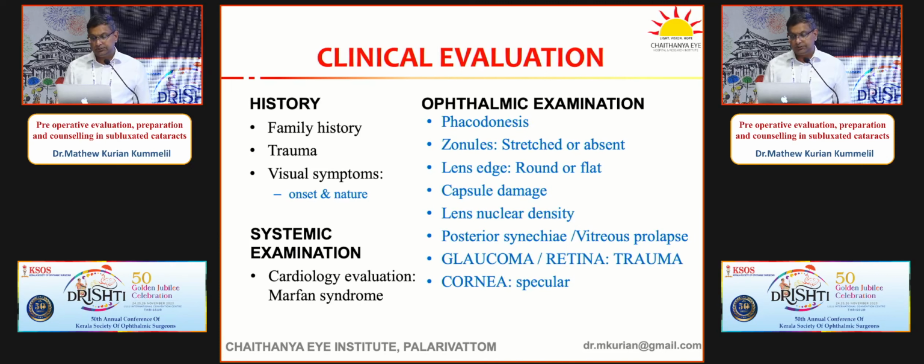For ophthalmic evaluation, look again for phacodonesis, because subtle phacodonesis may be the only indication preoperatively that this is a person in trouble. Get the pupil as well dilated as possible. Ask the person to look extreme left or right while looking on the slit lamp from the other angle to see if the edge of the lens equator is visible.